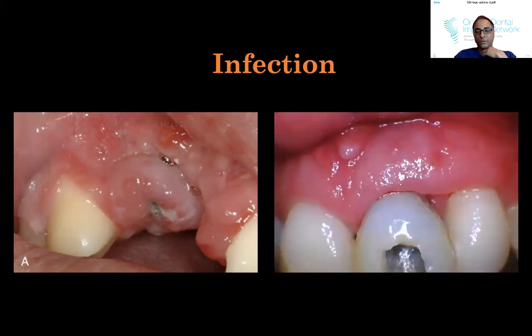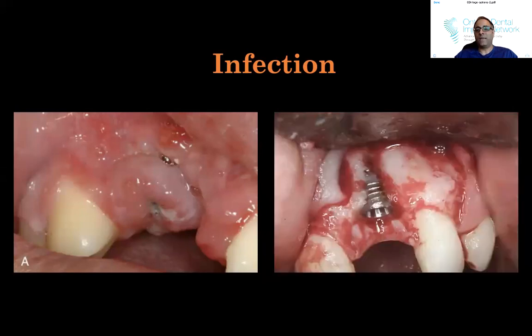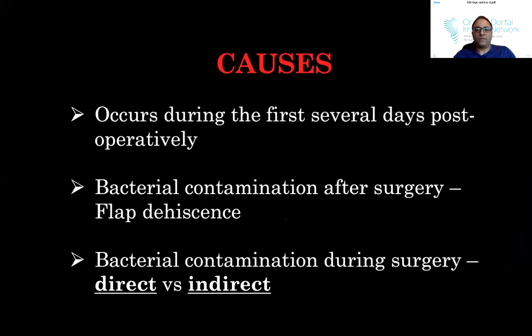So far, so good. So again, infection can occur at multiple stages, even post-operatively, because we never saw this infection actually during the healing phase, and the patient had an immediate temporary crown. So again, the bone clearly did not take in this case. And then there's the regrafted site and everything's healing up so far.